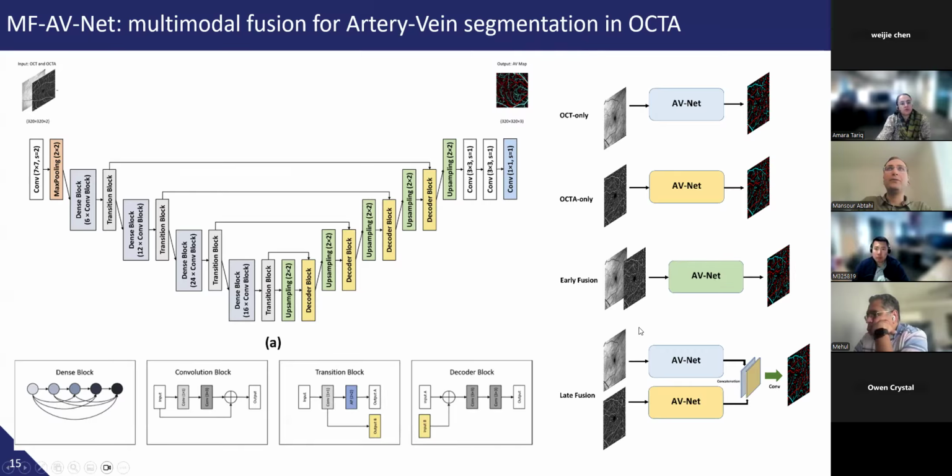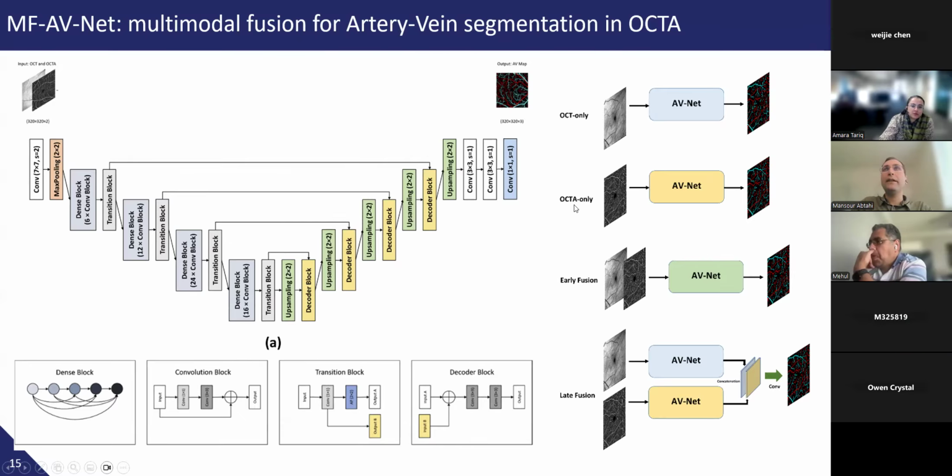So the output of this study gives us the idea that when we use OCTA-only, we are not losing too much accuracy compared to the late fusion architecture.